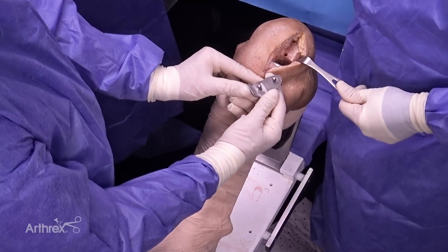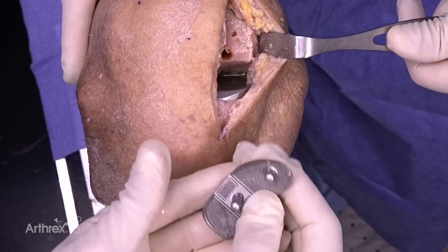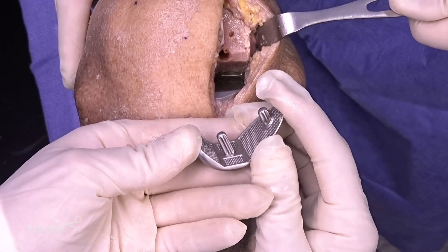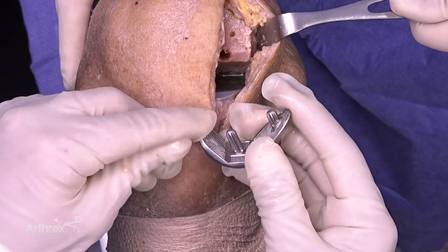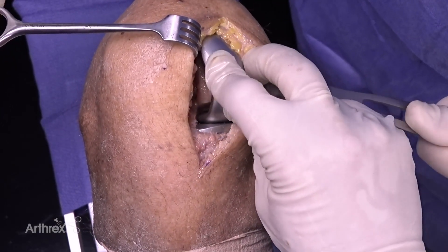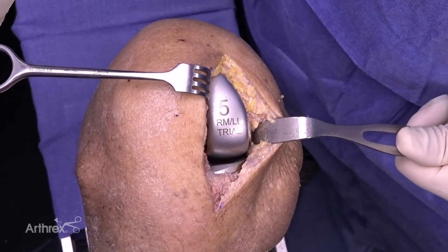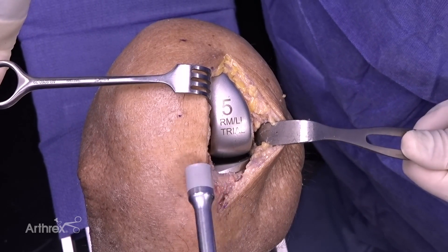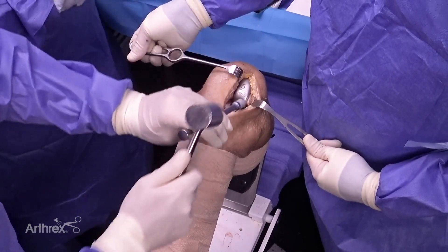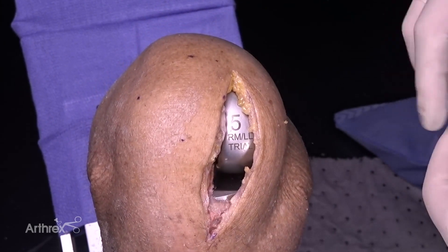I cement the femoral component using a very similar technique. I start by placing cement into the lug holes on the femoral bone, then coat the backside of the femoral component covering the cement pockets, leaving the lugs free for visualization. The first thing is to get the posterior lug lined up with the posterior lug hole. Once in that position, I gently extend the knee while the assistant pulls the patella laterally. Once the patella is out of the way, you rotate the femoral component over and into place, then flex it back down. We use an impactor in line with the lug holes and gently impact it, using different levels of flexion and extension to get extra cement out.